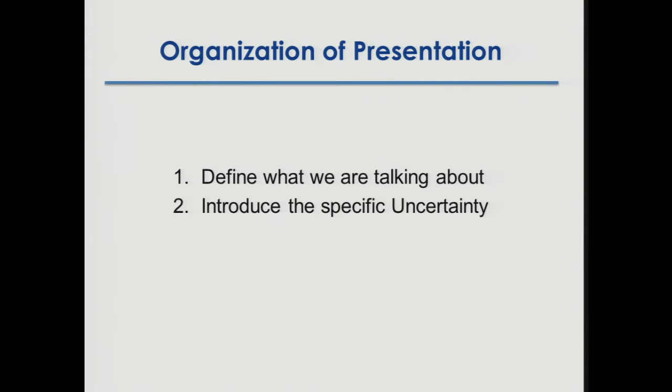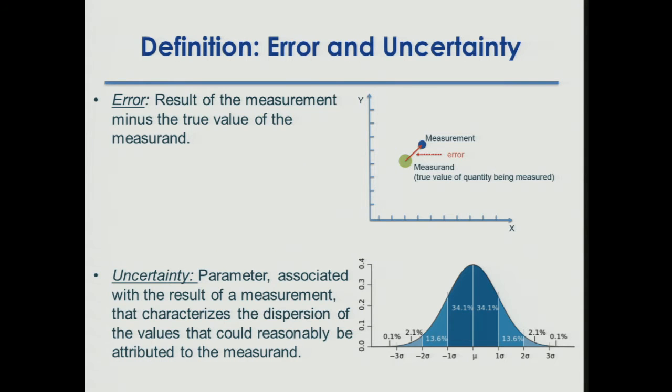Let's talk about the organization of my presentation first. I'll first define what we're talking about, accuracy of language. I will then, as I go through my slides, introduce the specific uncertainty I'm talking about, give you an example on the Linac, because that's what we're most familiar with, and also give you an example on the CyberKnife to compare and contrast.